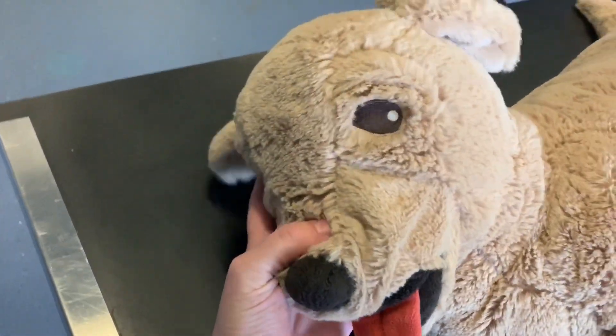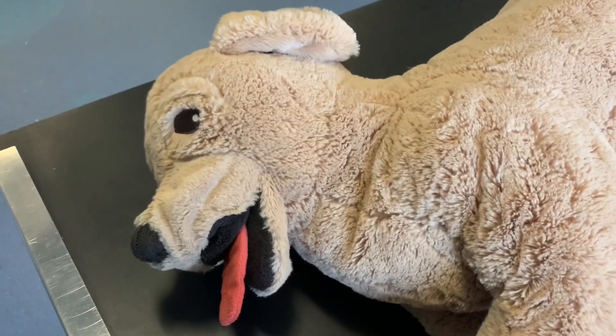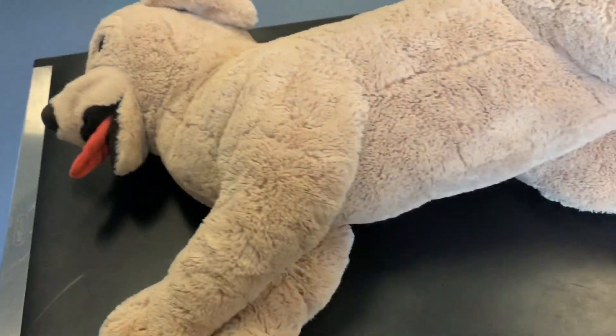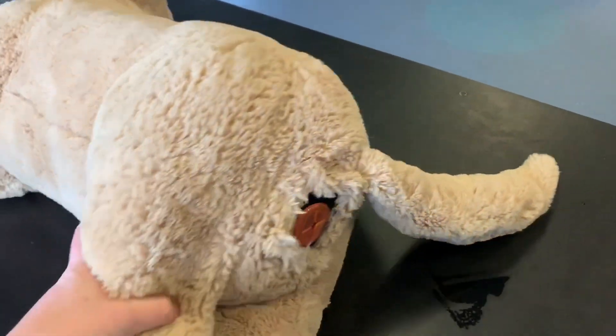This is Roger, the base model for the anal gland expression and rectal palpation model that I'm working on. He's just an Ikea soft toy dog, so you could use any soft toy dog to make this model. The interesting end of Roger is, of course, the caudal end.